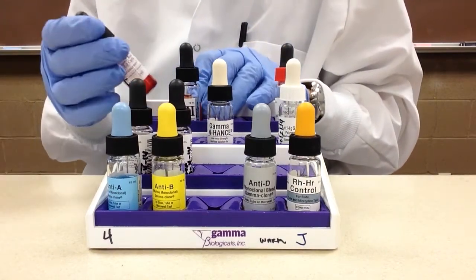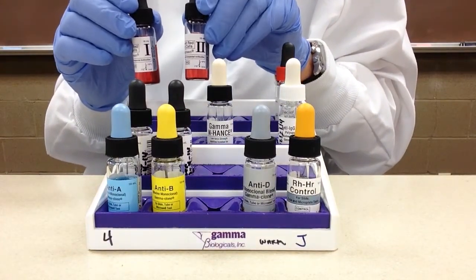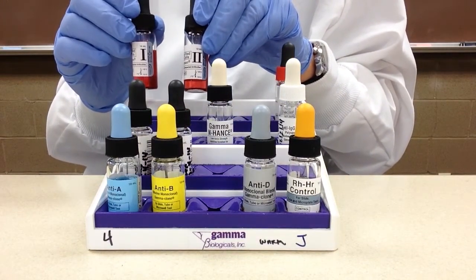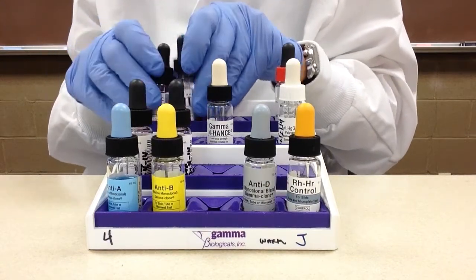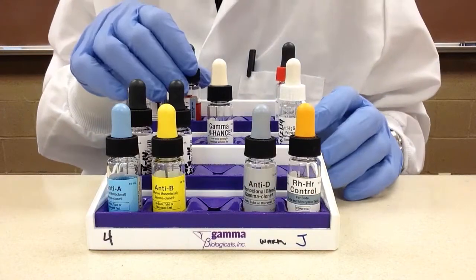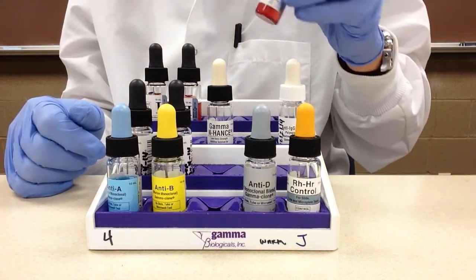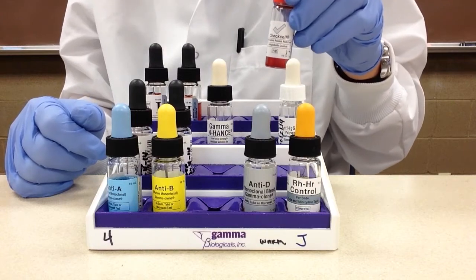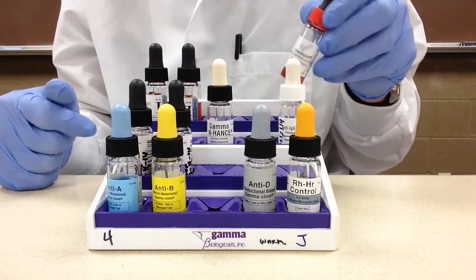Behind that we have our screening cells. In this lab we do cell lines one and two, though three is also common. Over here is where we have the check cells, also called Coombs check cells.